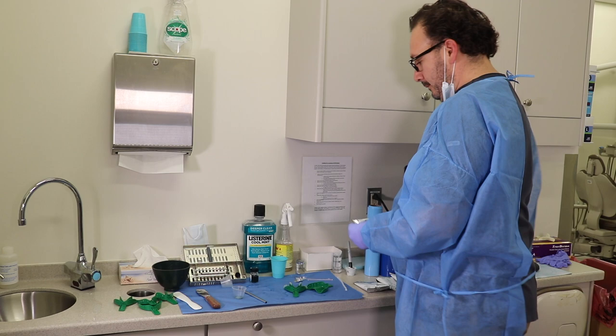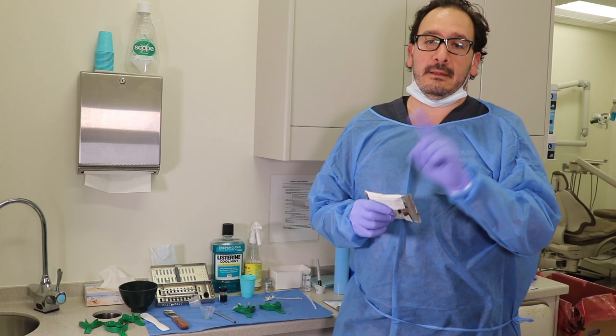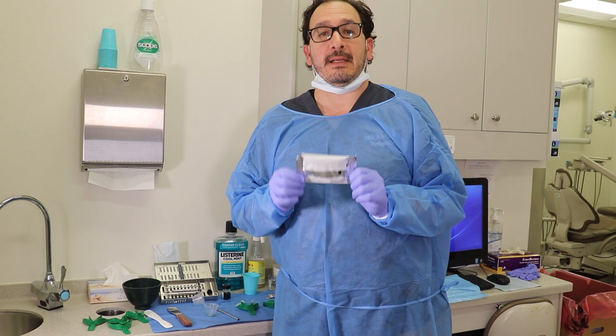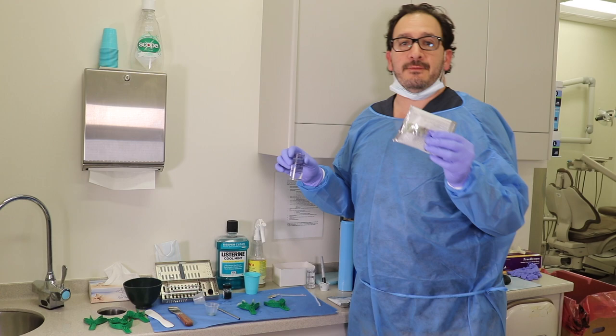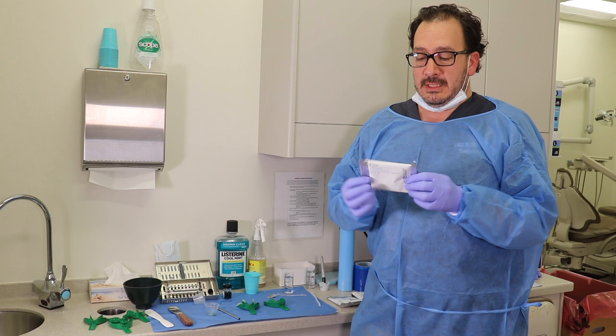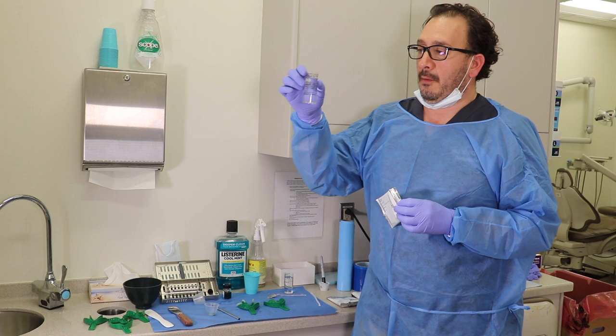Now, when it comes to alginate, it's an irreversible hydrocolloid. Irreversible hydrocolloids are one-time use, okay? And some very important facts about the alginate is the measurement of the water, the water ratio mix. It's very important to get the right consistency. When you're using pre-measured alginate, like this one is 3 scoops of alginate, and you will get a measuring cup that has also 1, 2, 3 scoops of water.